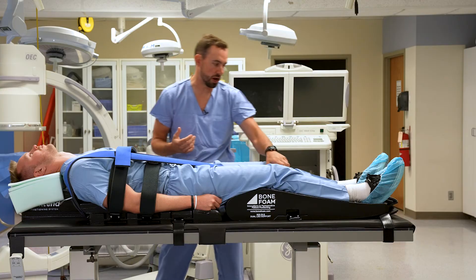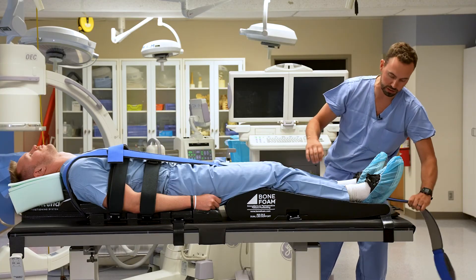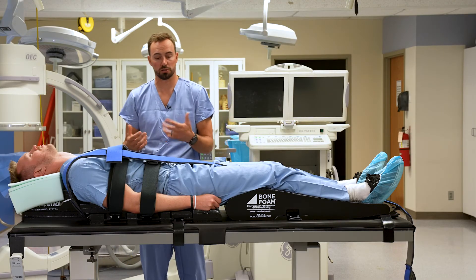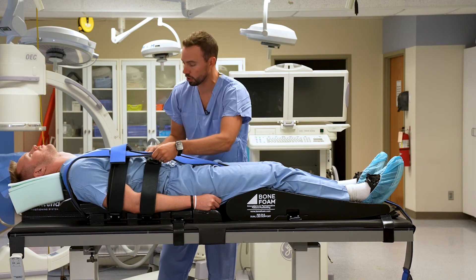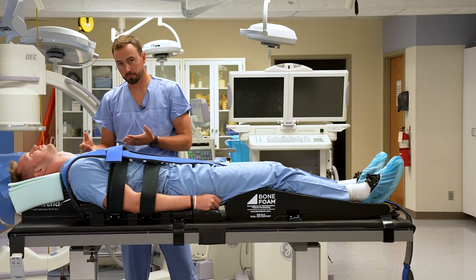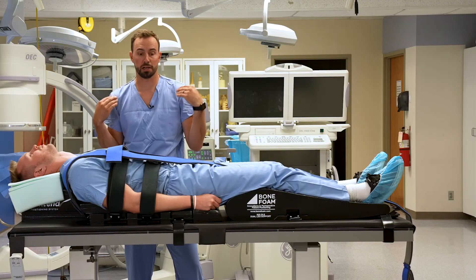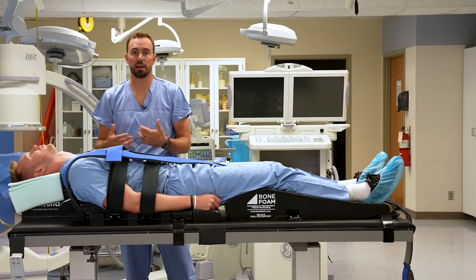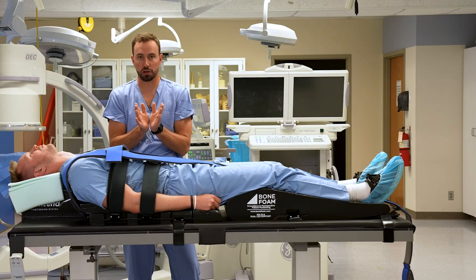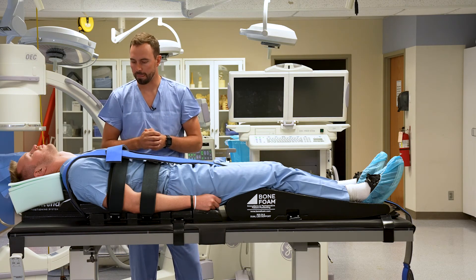The Y-strap also offers the ability to do intermittent traction because of its long strap. We can let it lay loosely over the end of the table with the yoke keeping the straps in position, and a surgeon can request depression of the shoulder girdle just when they want to take a lateral image, rather than having static traction throughout the case. This is beneficial because with tape, you have no ability to do that. Additionally, if traction is asymmetric — pulling harder on one side — the patient is at risk for a brachial plexus injury. The Y-strap provides symmetric depression of the shoulder girdle and the option for intermittent traction, though ultimately that's up to the surgeon.